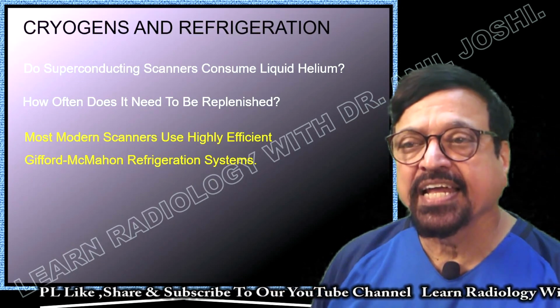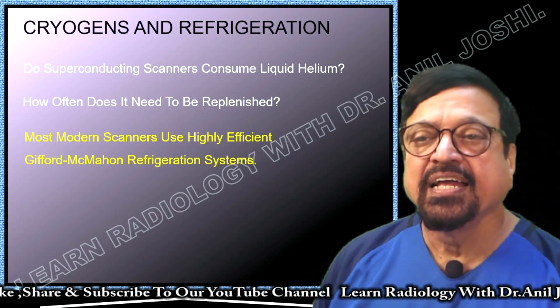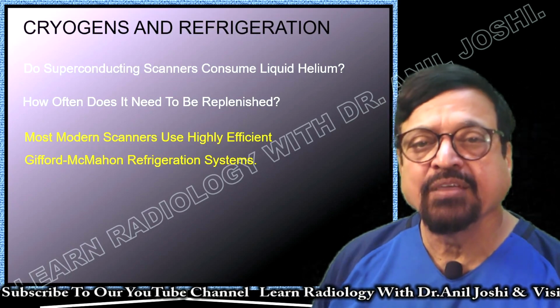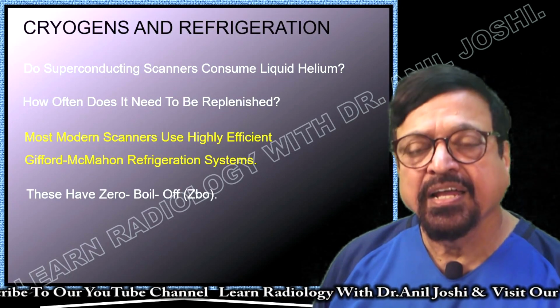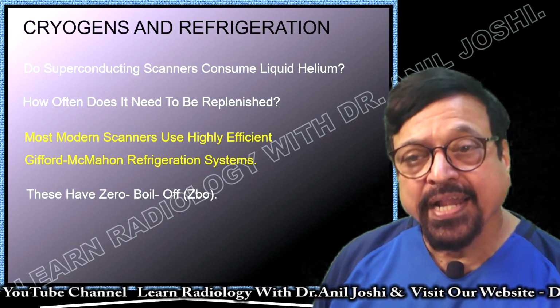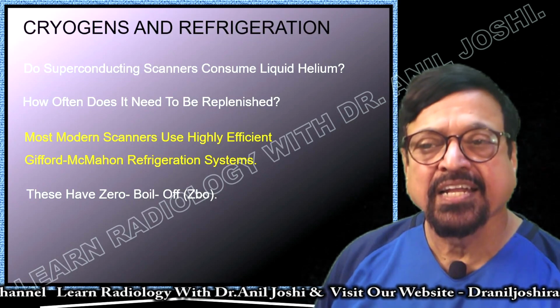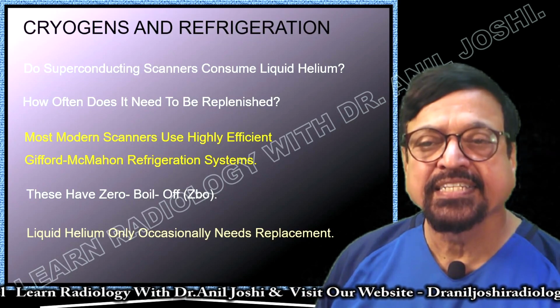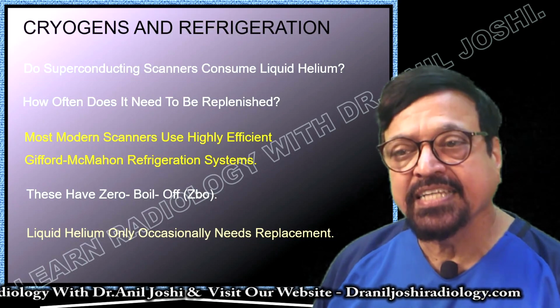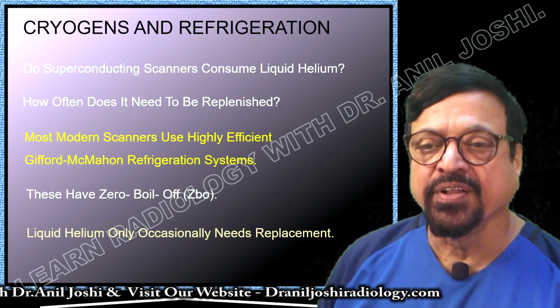Most modern scanners use a highly efficient Gifford-McMahon refrigeration system. This deals with cooling the helium and keeping it in liquid form, to avoid helium loss as far as possible and come near zero boil off. That is the aim we are trying to achieve, and what we are using for this is the refrigeration system by Gifford and McMahon.